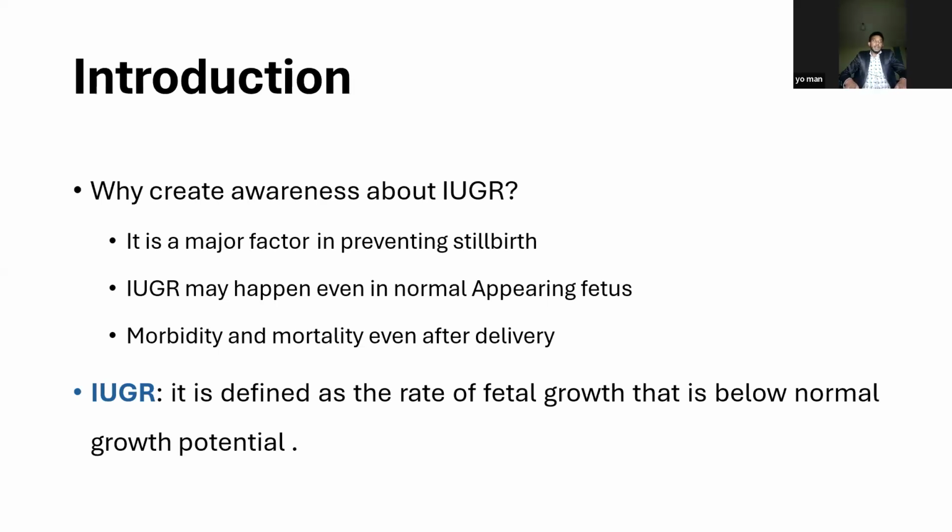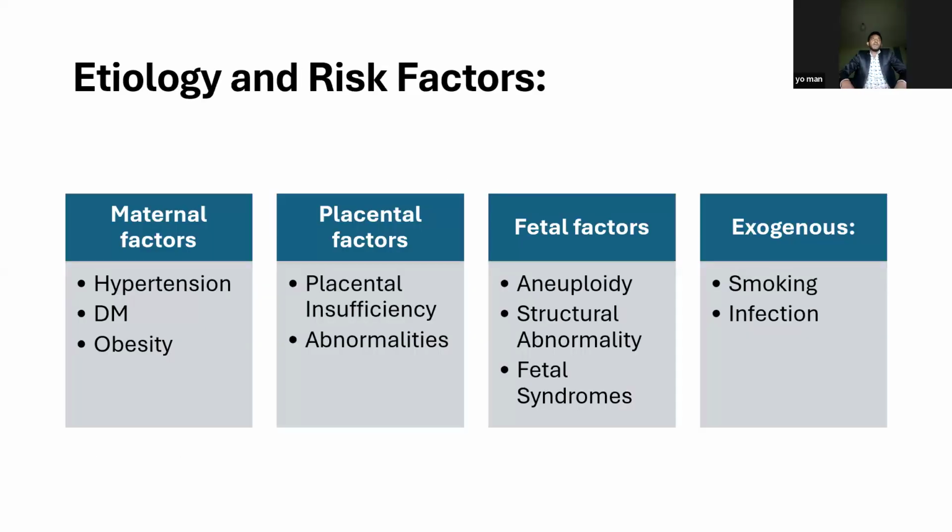For the time being, let's arbitrarily define what IUGR means, without considering any clinical data or ultrasound-specific parameters. IUGR is defined as a rate of fetal growth that is below the normal growth potential. This is just an arbitrary definition of an IUGR fetus.